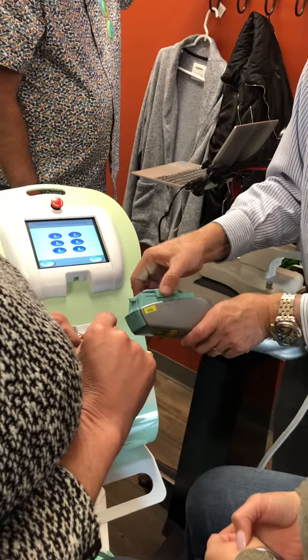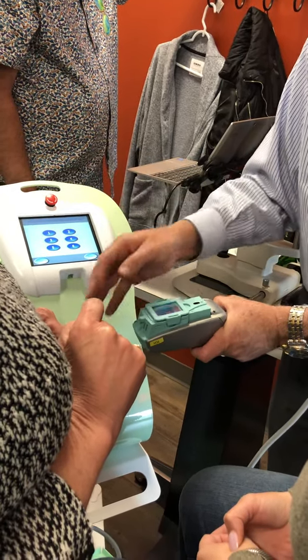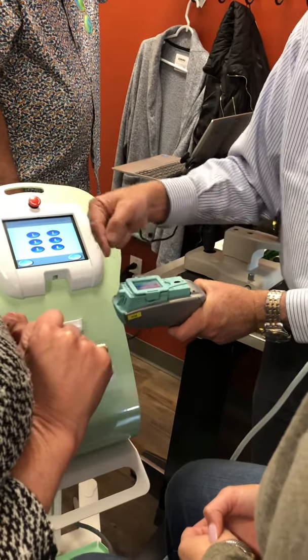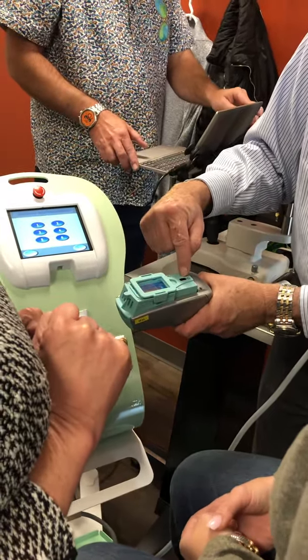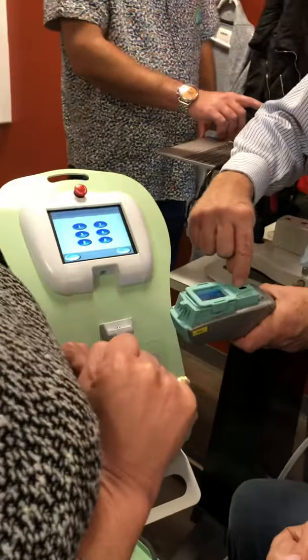Okay? This diffuser comes off, so if for any reason it ever got dropped or whatnot, and this is a piece of glass, it's a UV glass, there's a spare one in the box. Okay? See the photocell right here? Oh, so you don't charge us like $200 a treatment for those? No. Okay, so see the photocell?